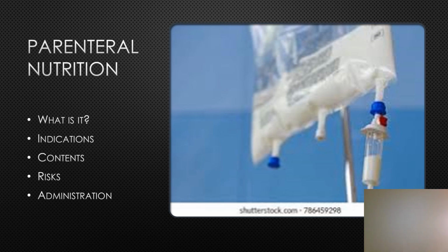Monitor the client's overall status, and when discontinuing, we should wean it over 24 hours rather than discontinuing all at once. The solution container and administration set, don't forget, need to be changed at least every 24 hours.